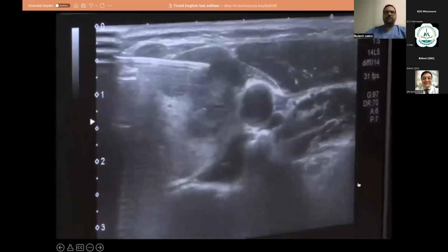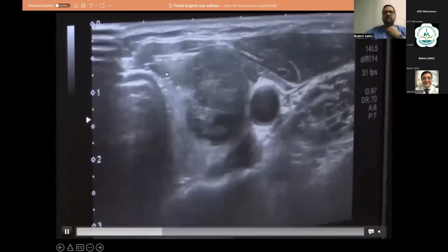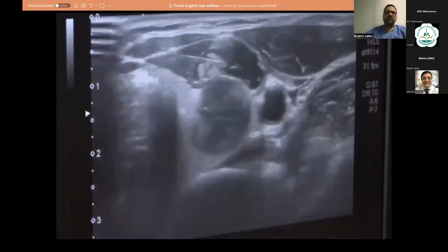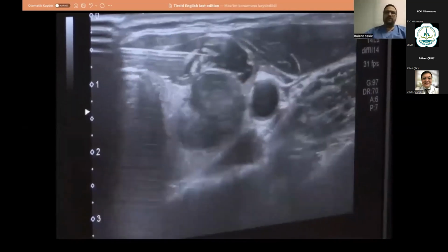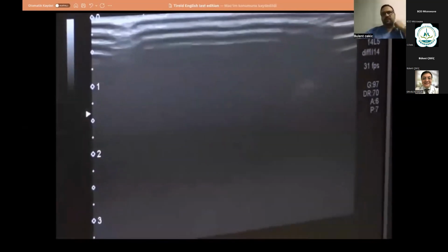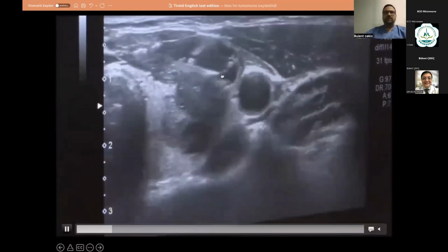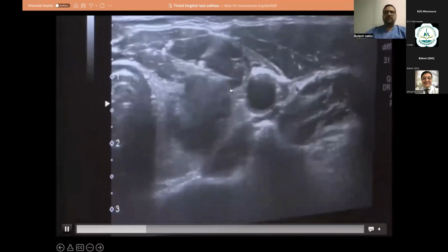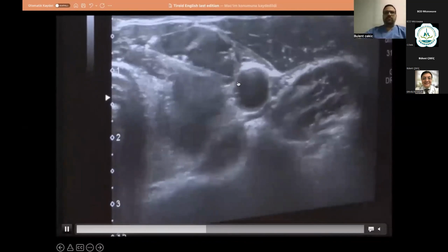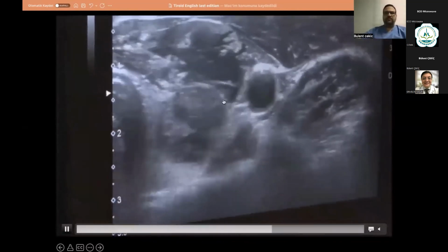Here is another patient. We give lidocaine again. I usually use one entry point, and after I give the lidocaine, I do not change the needle; I give the dextrose with the same needle. And here I navigate the needle, and then I push 20 cc dextrose, and then we have a safe zone for hydrodissection, as we see.